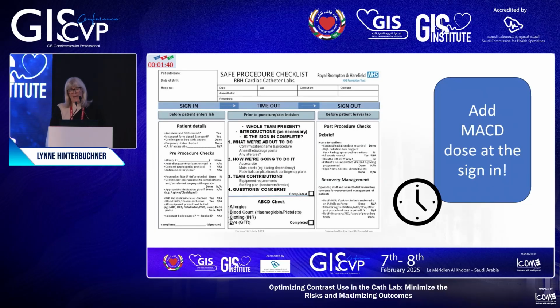Part of your checklist, this is a sample of one. You can see here on the left-hand side, they have the creatinine level listed, but they're not telling you what the maximum dose should be, what level you can get to. And at the end, again, they talk about how much contrast was given, but it doesn't tell you what the maximum dose was. So you can't really see what risk the patient is at.